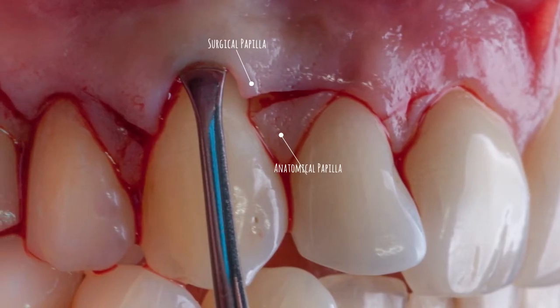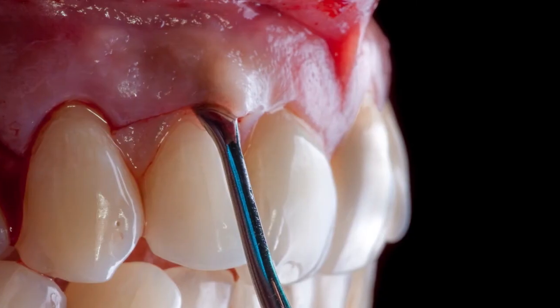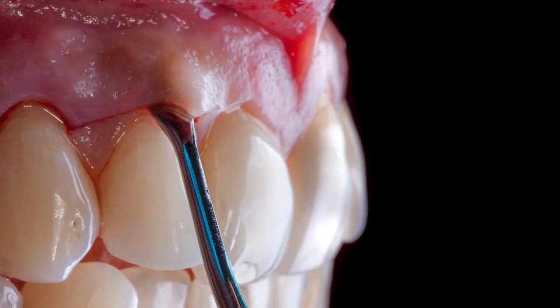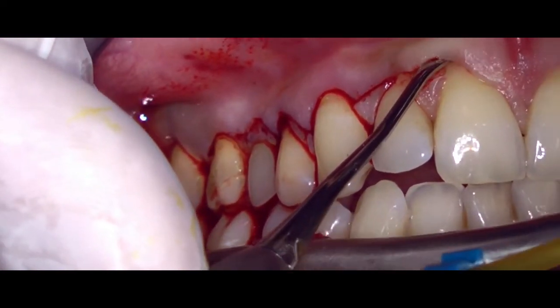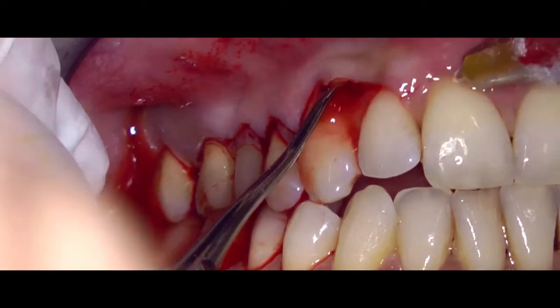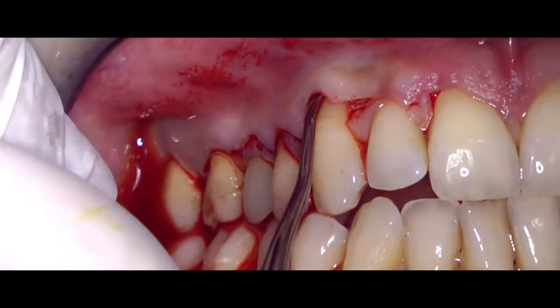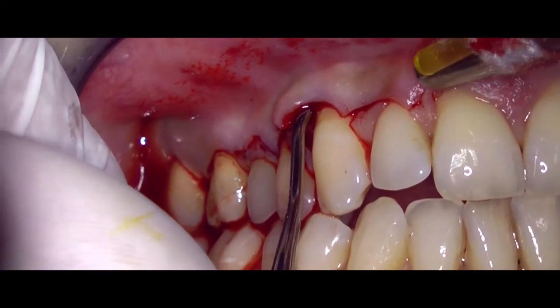So now we start to reflect the tissue using a small instrument, and this time we will go full thickness, making sure that we expose roughly 3 millimeters of bone apical to the bony dehiscence. The idea here is to keep an adequate tissue volume and also to allow for a portion of periosteum to cover the root.